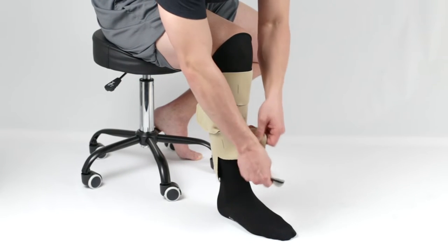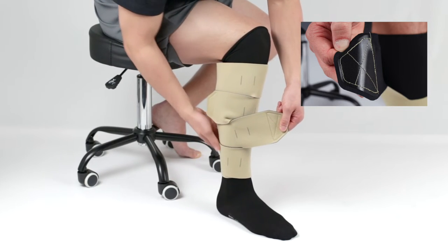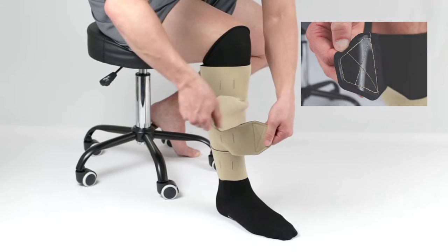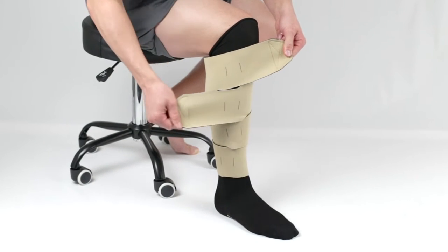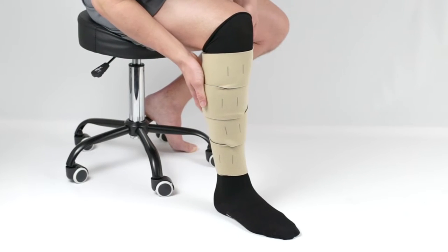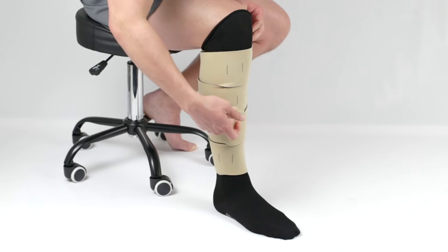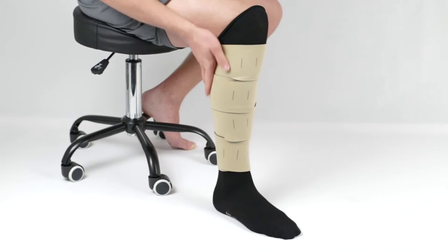Unroll the bottom two bands and secure them to the outside of the legging to a firm and comfortable compression level. While holding the second band, detach the next band and continue this process with the other bands going up the leg. Ensure that the bands are placed in an alternating order. The garment should lay flat and wrinkle-free against the leg.